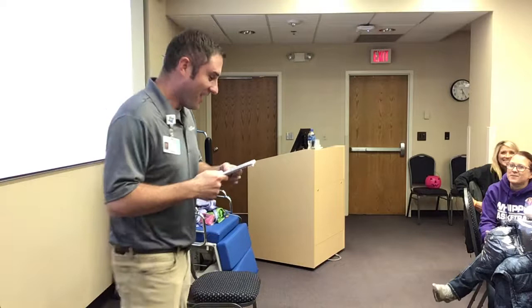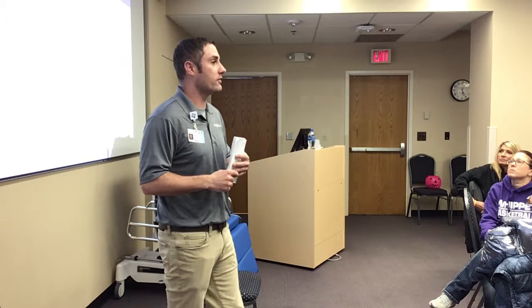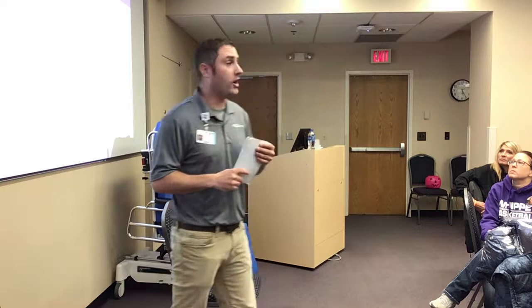Let's talk about levels of mobility first. First and foremost is dependent. This patient is unable to help at all. The caregiver is doing 100% of the work. So you are basically always going to use a full lift for a patient who is dependent.